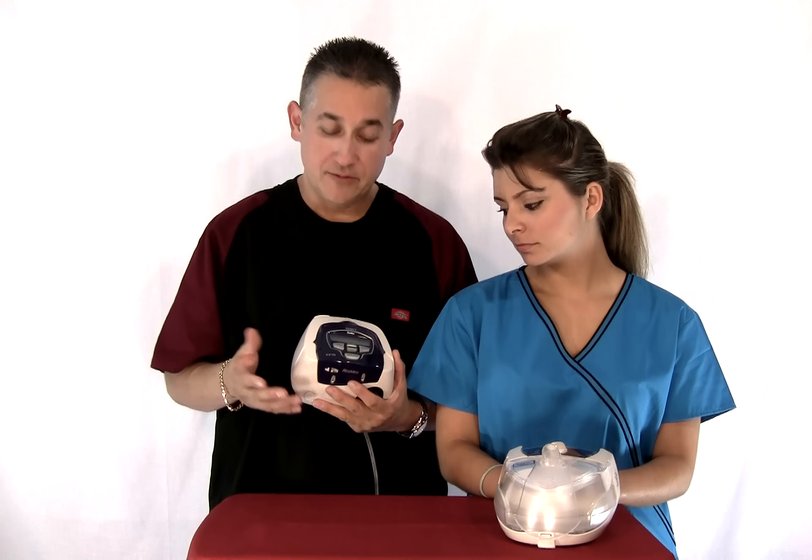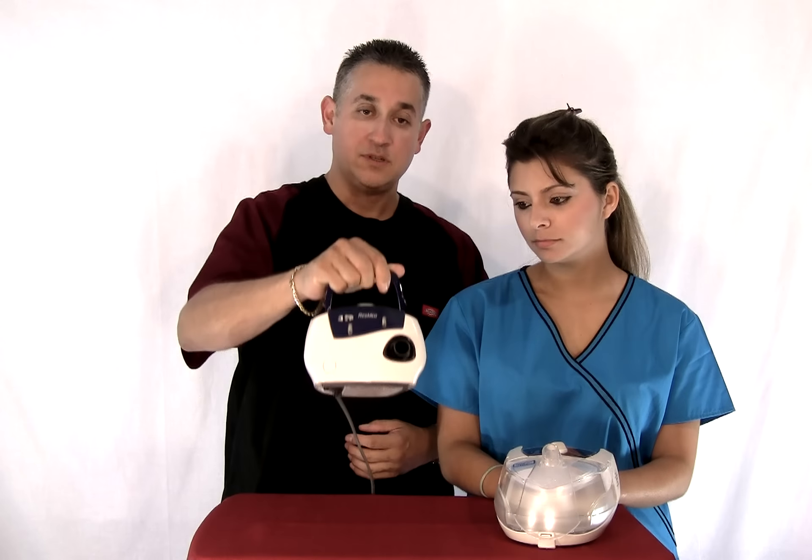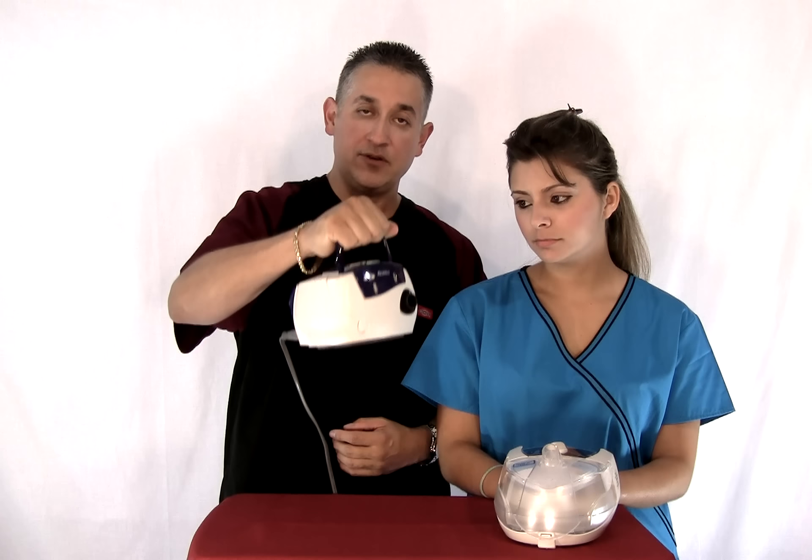This machine has a couple of real neat features. First of all, it has a handle, which is very unique to most CPAP machines. It's got a nice little handle if you need to carry it.